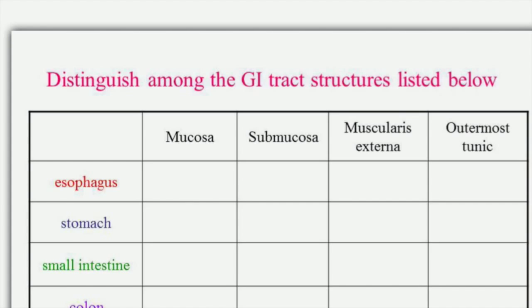In case of the colon and the cecum, it is lined by the surface or absorptive columnar cells with goblet cells, no villi but only crypts which are very wide and deep and full of goblet cells. In the submucosa, we don't have any additional feature in the colon. In the muscularis externa, we have inner circular and outer longitudinal in the form of taenia coli. The serosal covering shows the appendices epiploicae.